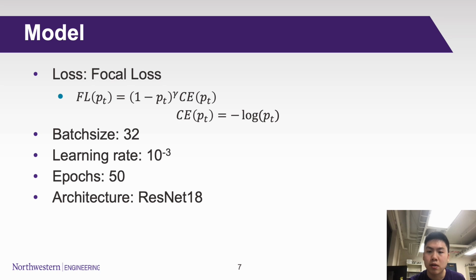In the context of this classification task, ResNet 18 has been used as the backbone of the deep learning model to detect and segment the chest X-ray images. ResNet 18 has the ability to learn complex patterns and features from images, making it a powerful tool for medical image analysis. Its architecture includes residual blocks that allow for the efficient training of deep neural networks, making it an ideal choice for this task.